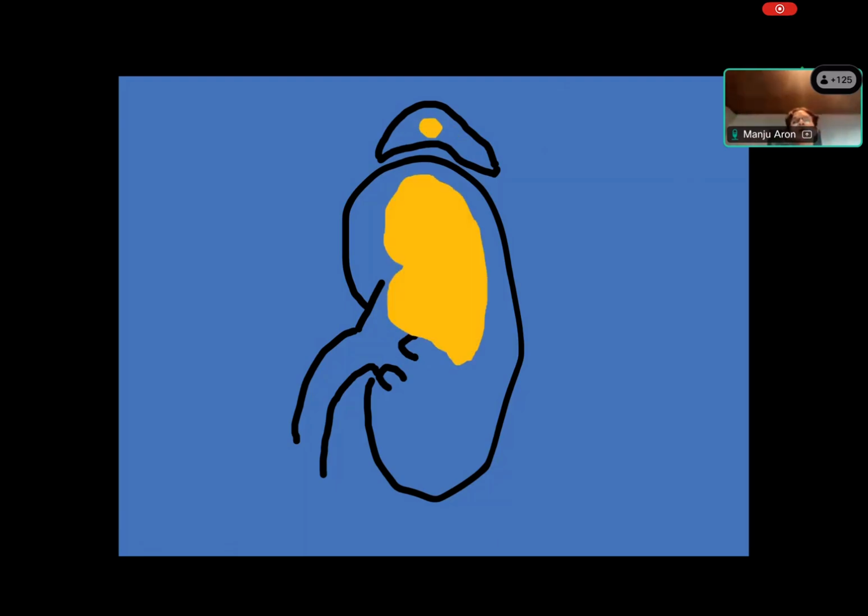Now, here's an example where there's tumor, but this tumor is distinct from the tumor that you see in the adrenal gland. That's important because this will represent metastasis and not direct extension. So all these things are important to document when you're looking at a tumor.